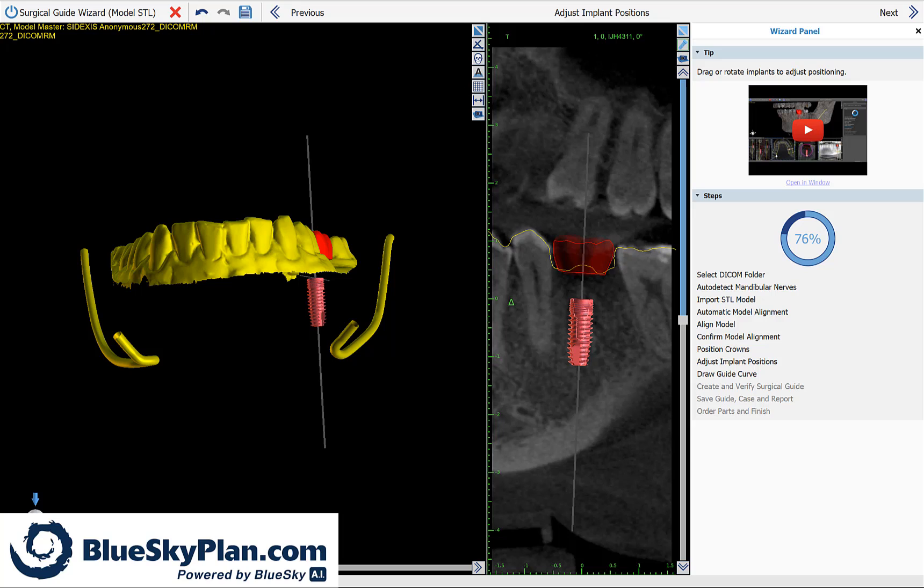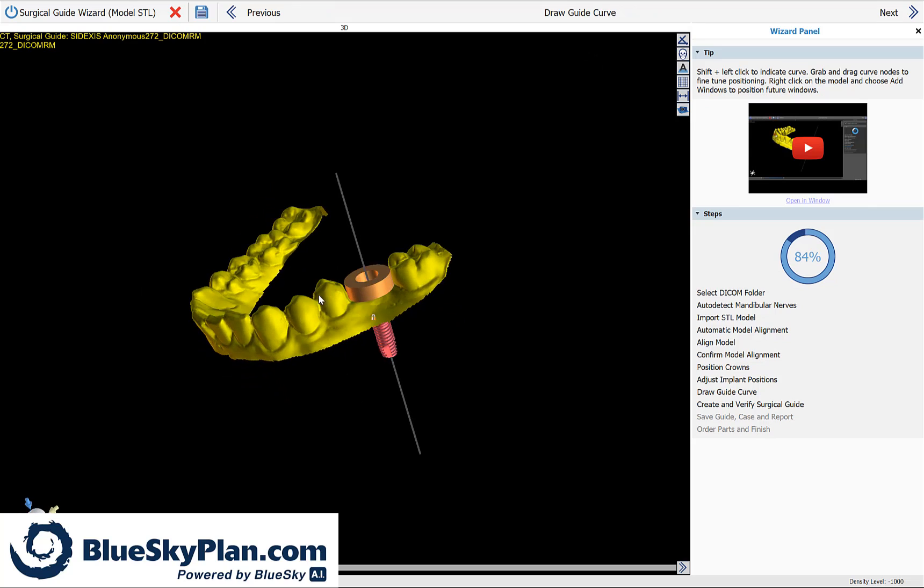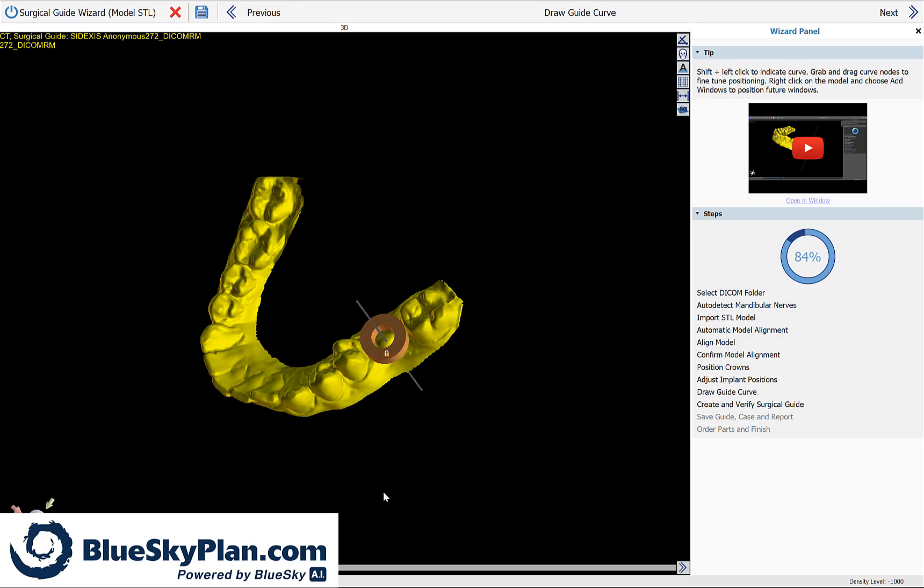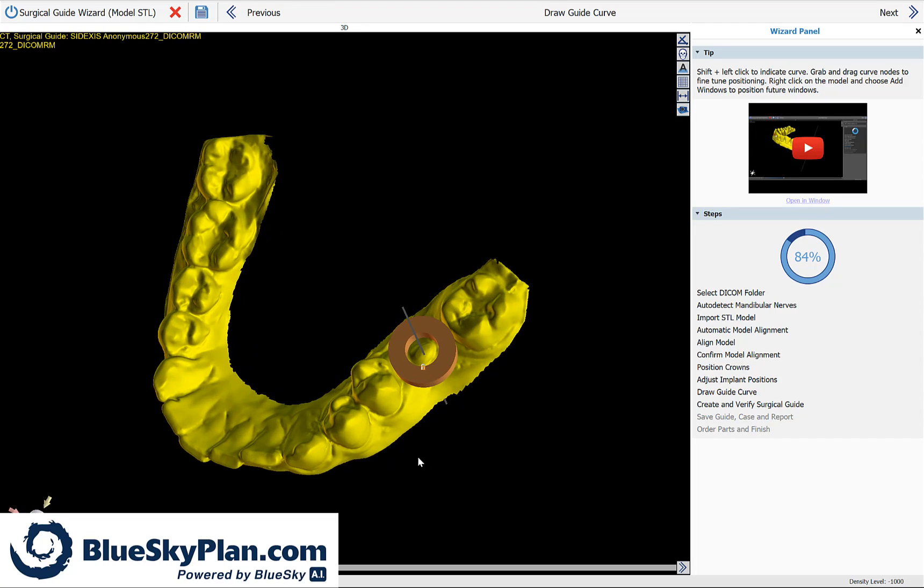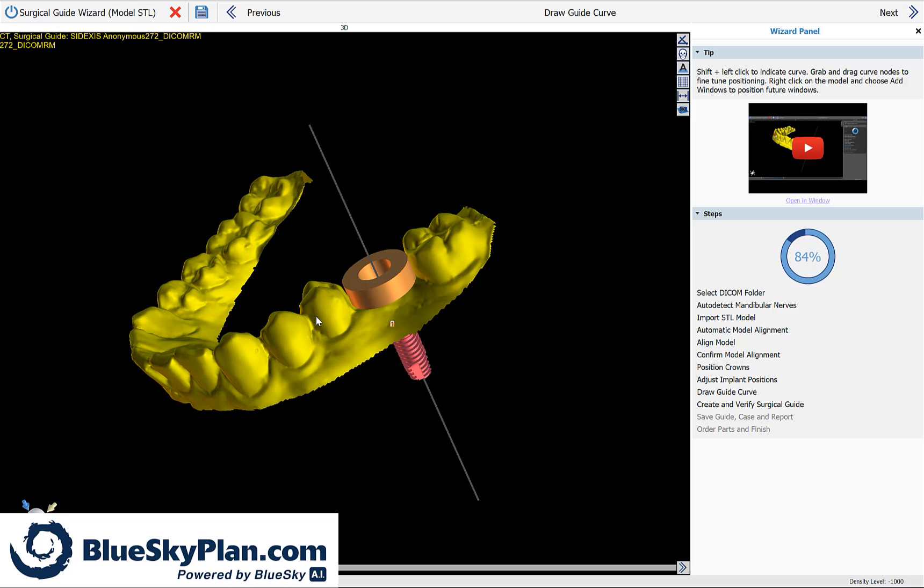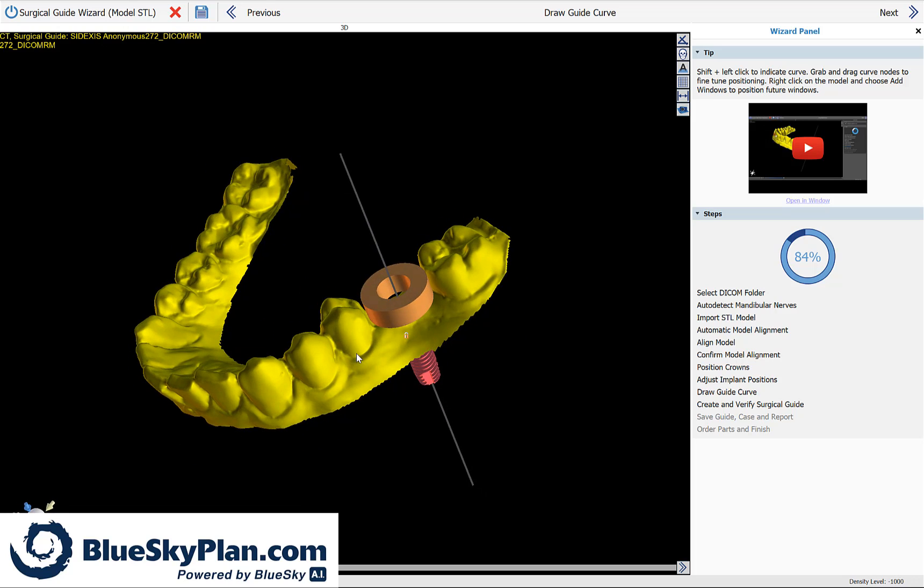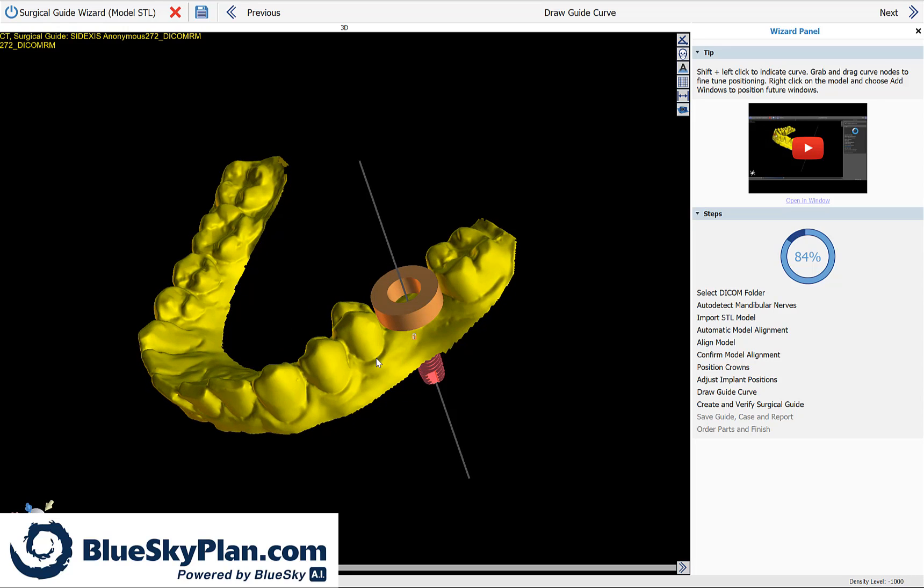And now we'll continue with the wizard step-by-step tutorial by clicking on next. We could see the implant, the model, and the brown software guide tube. The brown software guide tube represents the exact positioning and size of the hole that's going to be in the surgical guide. We're going to proceed now by marking our surgical guide curve.